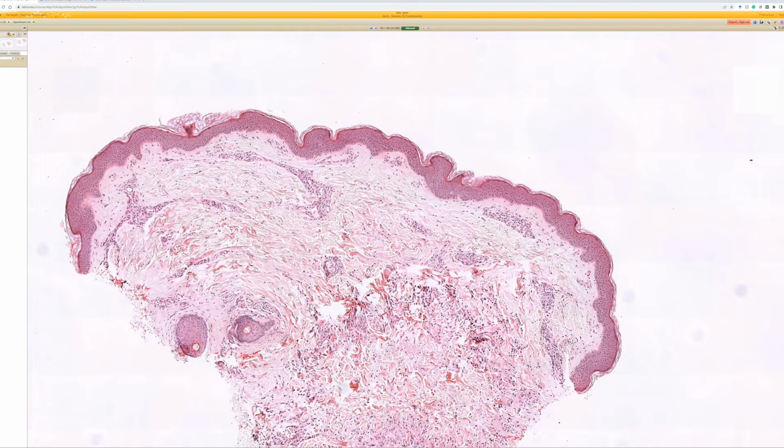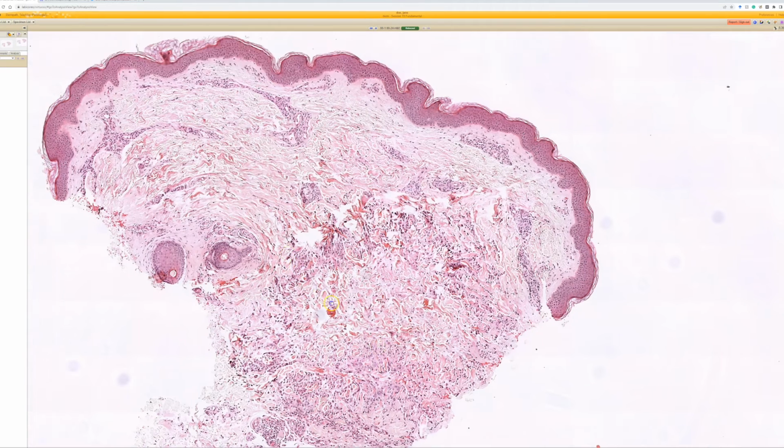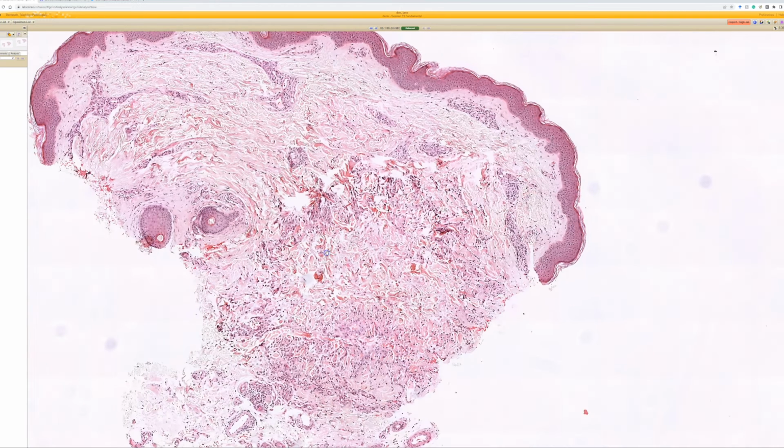So if they thought it looked like a tinea clinically, and then I start seeing histiocytes microscopically, we're probably dealing with granuloma annulare. And then also there are forms of lupus that clinically, like SCLE form of lupus, can make ring-shaped lesions, and so that's another thing. If they were thinking about lupus and you see histiocytes microscopically, maybe it's actually granuloma annulare.